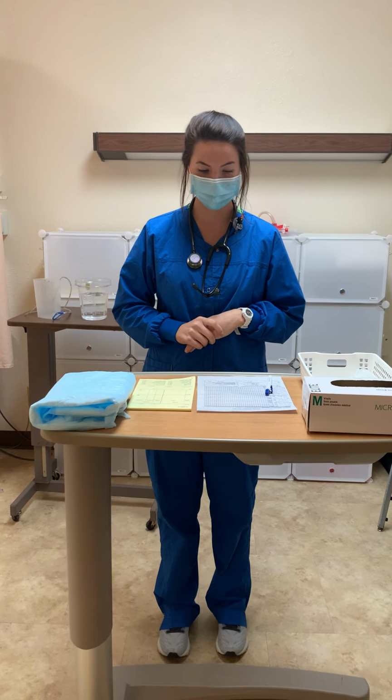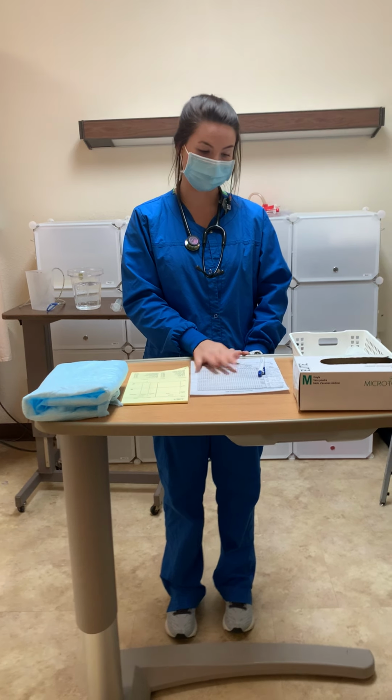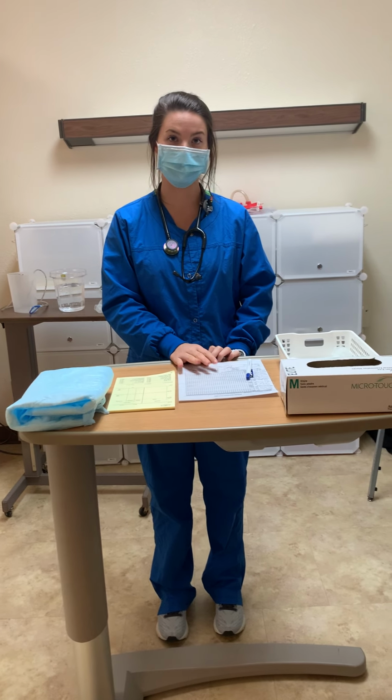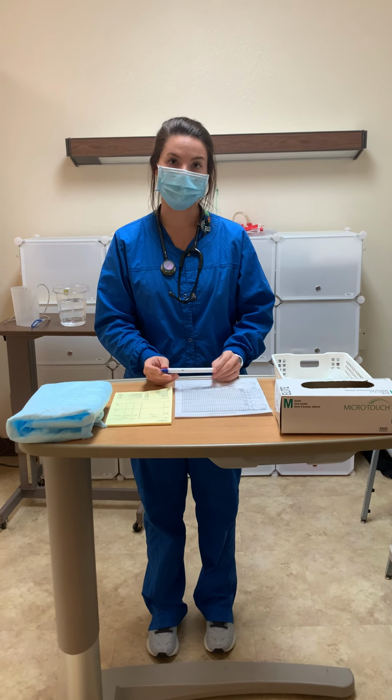So for this video, I'm going to be demonstrating how to document INOs, administering medication through an NG tube and a sub-Q injection, and then also doing a continuous feeding.